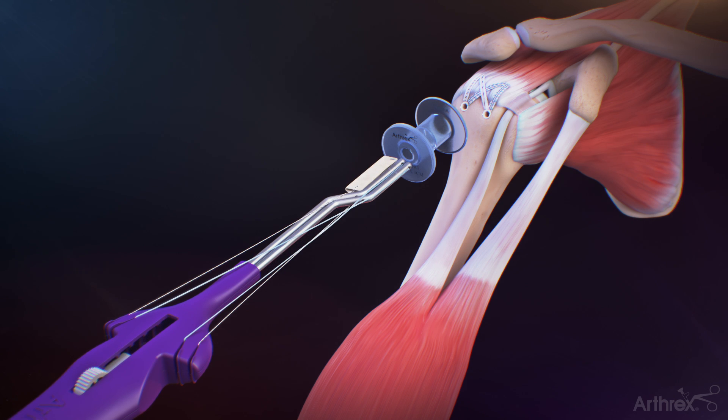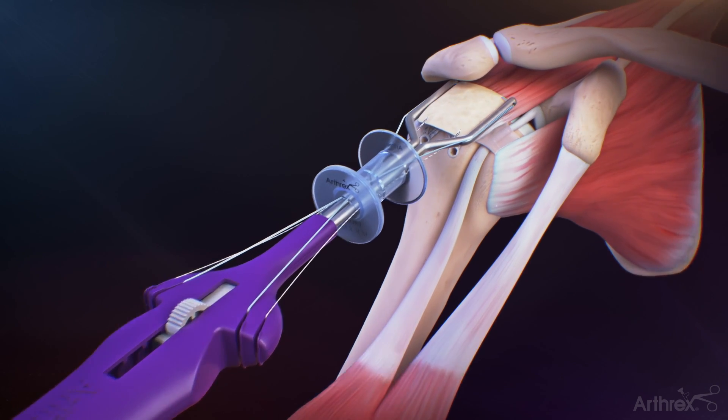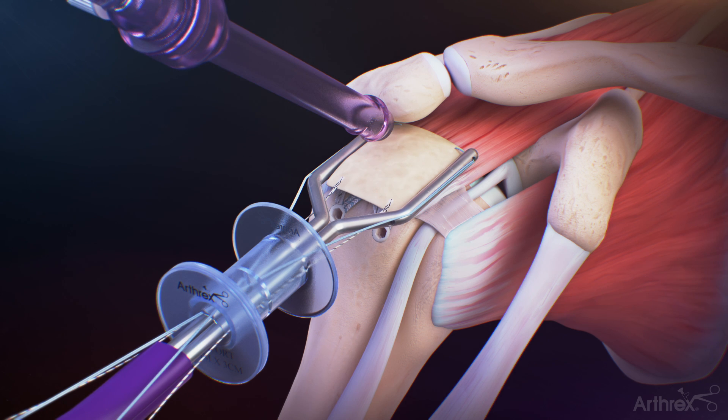Insert the graft and graft spreader through the lateral passport cannula. Once the tips of the graft spreader arms enter the subacromial space with sufficient clearance, deploy the graft spreader by sliding the button forward to fully deploy the graft. Introduce the tissue tack tendon anchor inserter through a 5.75 mm cannula located in the superior lateral portal just off the lateral edge of the acromion.